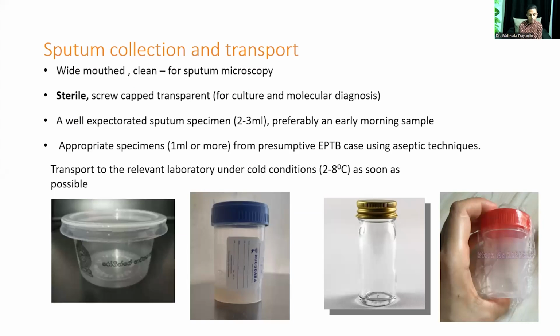So this first container is for microscopy. We tell them a wide-mouth clean container. The first looks like a yogurt cup, and this is replaced with this second blue top container, secured with a screw-capped lid. These are not sterile actually, they are clean containers.